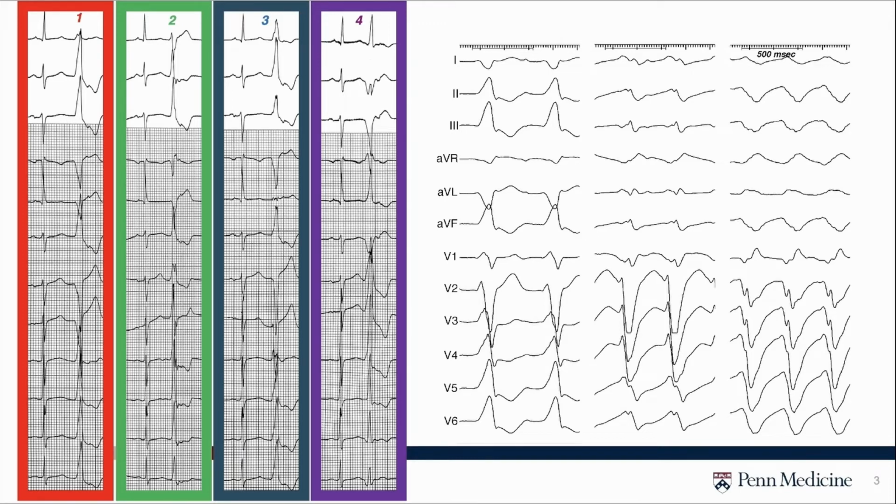The second patient, on the right side, is a patient with monomorphic VT. And similarly, you see there's a classic outflow tract morphology that was mapped to the LVOT. And then you have other flavors of exits of ventricular tachycardia on the right side with septal characteristics.